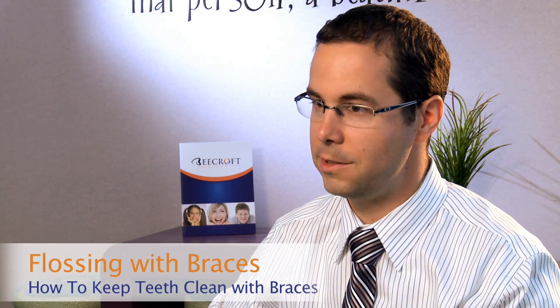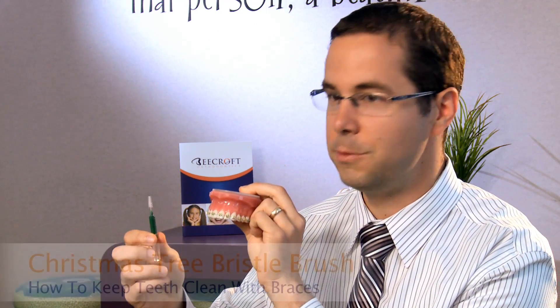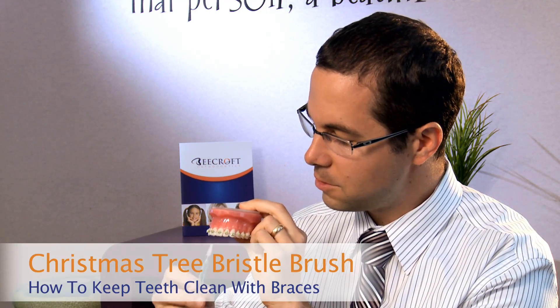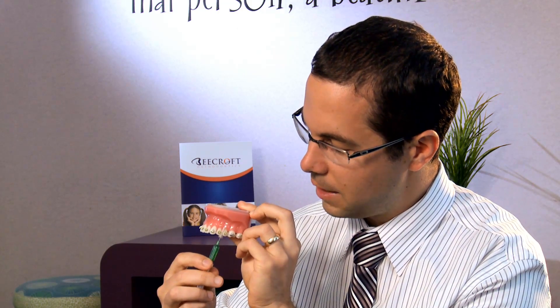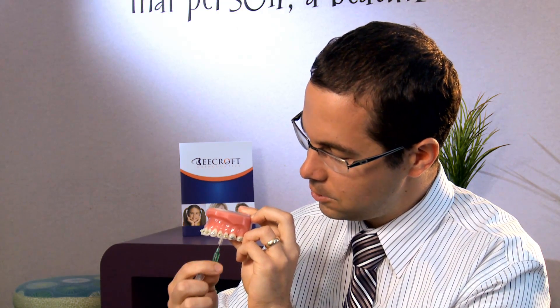So that's brushing. You also want to make sure you're flossing and keeping things really clean in between your teeth. One thing we recommend for getting large debris and food particles out is this little Christmas tree bristle brush. This is really nice for going underneath the wire. You can get in between the teeth, and really in the back where you get those sticky foods and pieces of meat stuck — just get right underneath the wire and you can really dislodge that food.